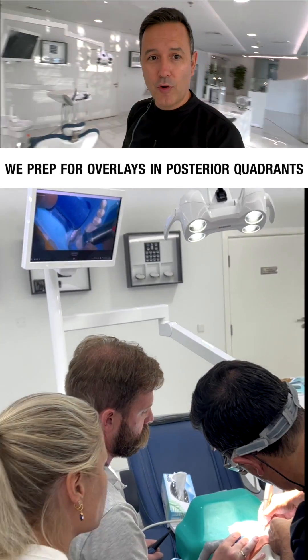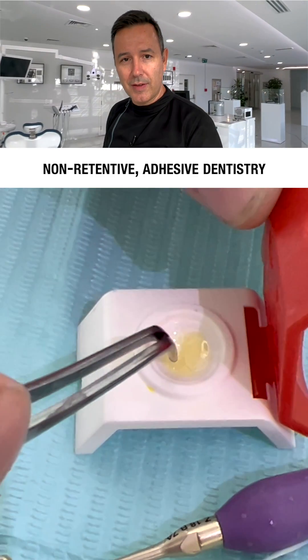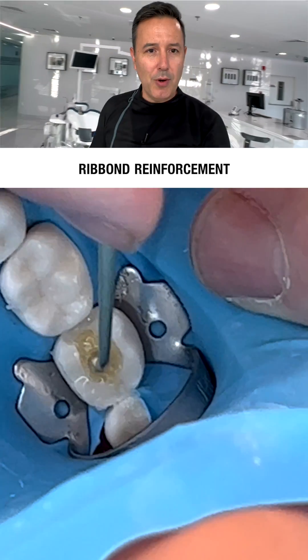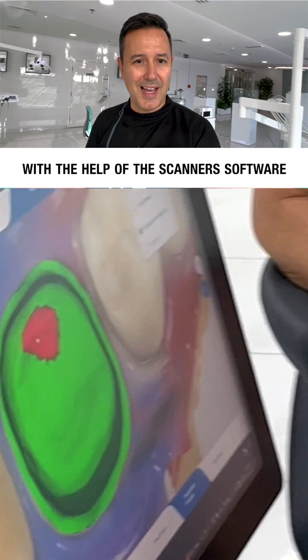On the second day, we prep for overlays in posterior quadrants. Some call it biomimetic dentistry — I just call it minimally invasive, non-retentive, adhesive dentistry. Prep with rubber dam and all the good stuff: immediate dentin sealing, Ribbond reinforcement, deep margin elevation, and scanning with rubber dam on and managing the restorative space with the help of the scanner's software.